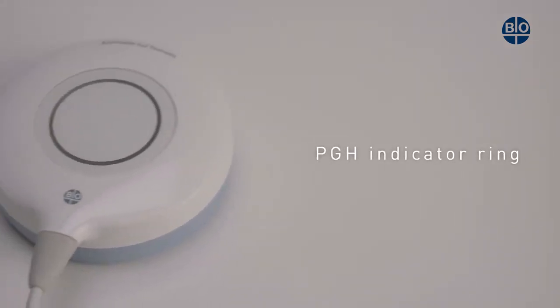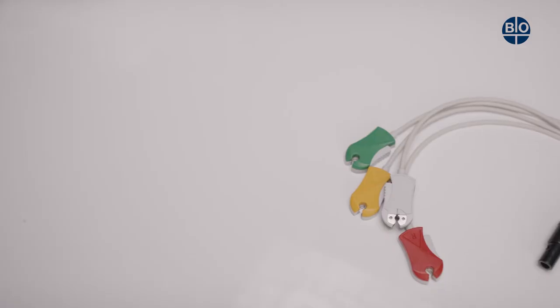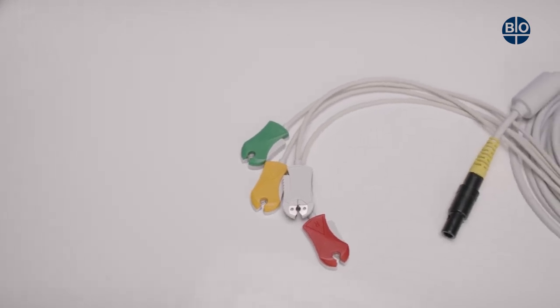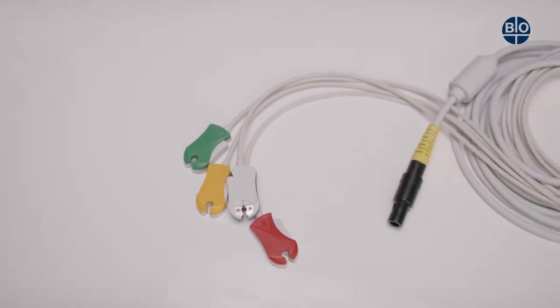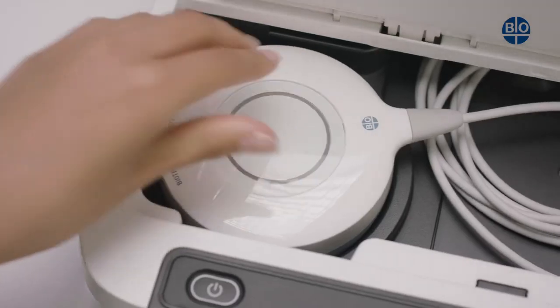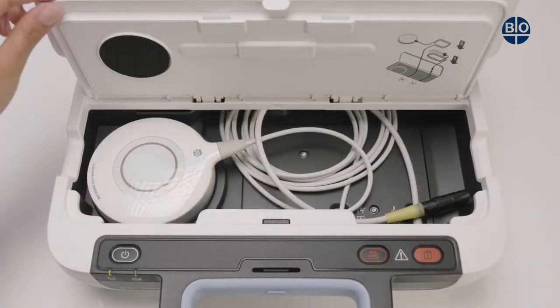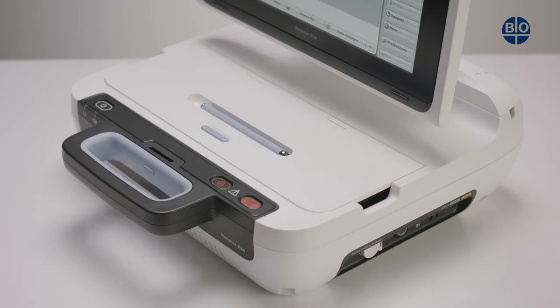The PGH has an LED indicator ring to show telemetry status and a length of 2.8 meters. The ECG cable has fixed electrode clips and a length of 4 meters. When the cables are returned to their compartment, they should be fixed in place with a downholder. There is also ample extra space in the back of the compartment.